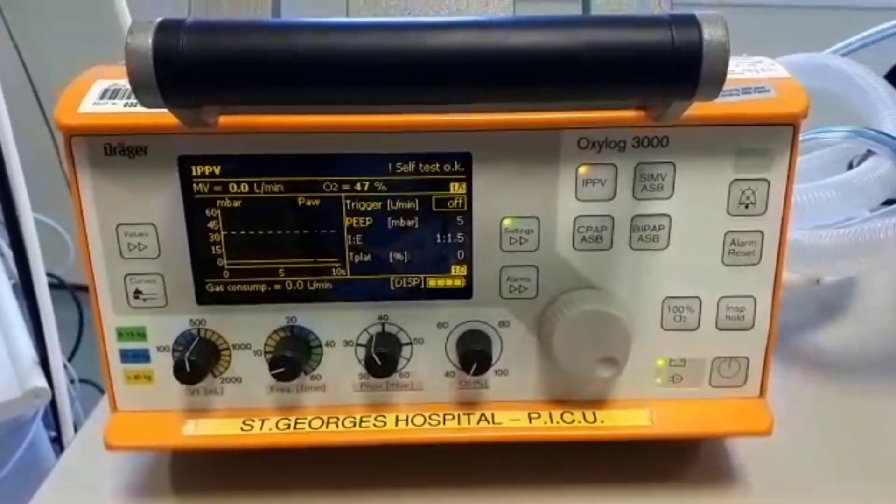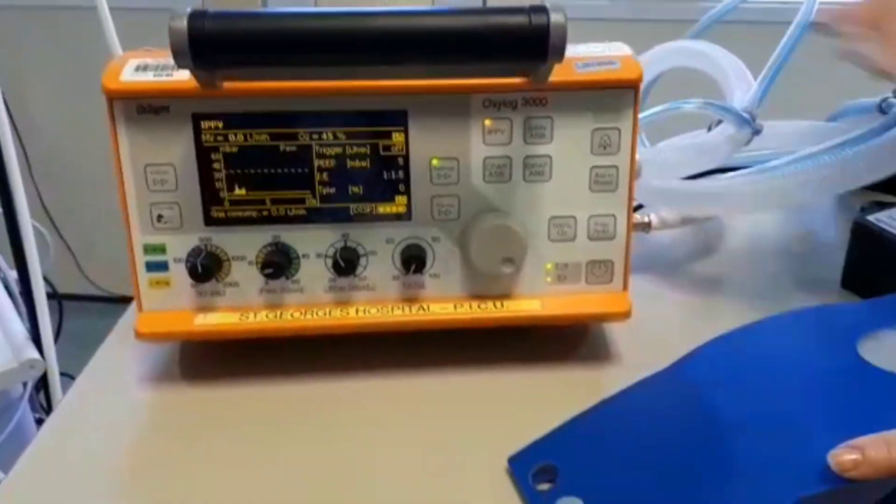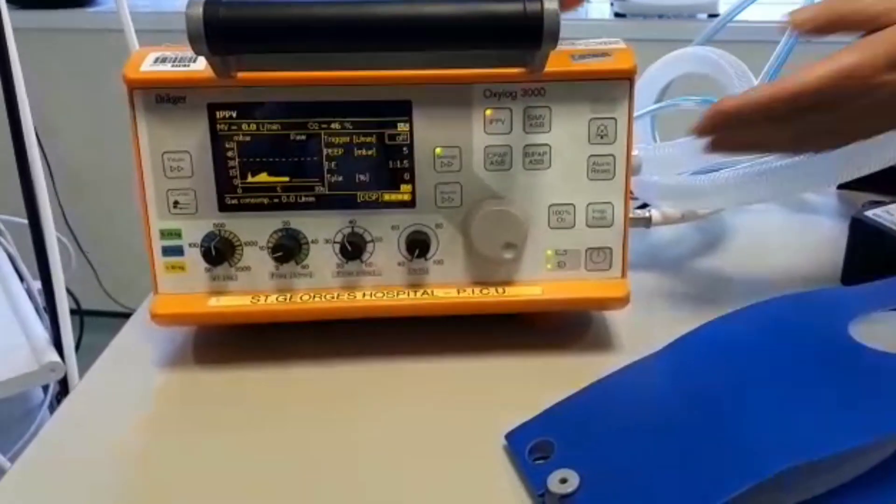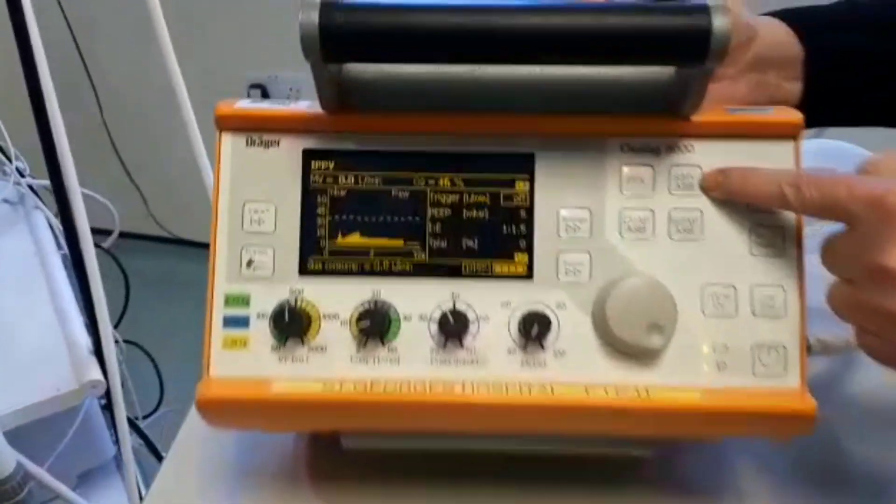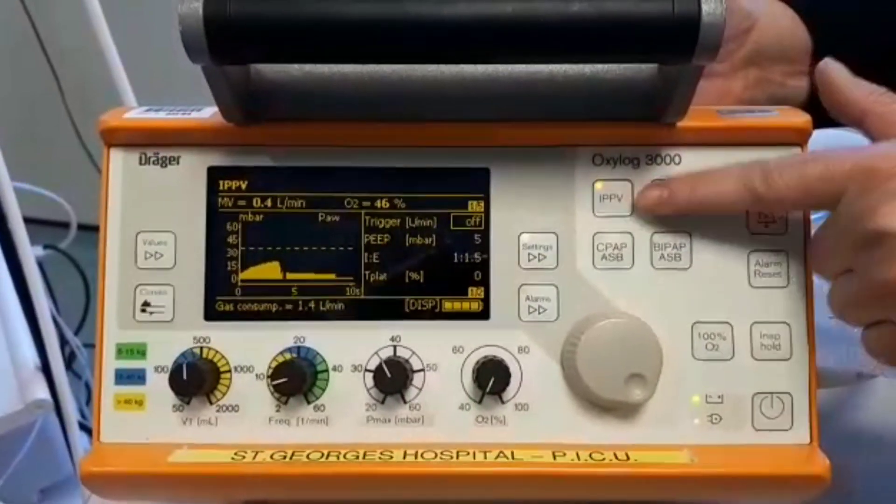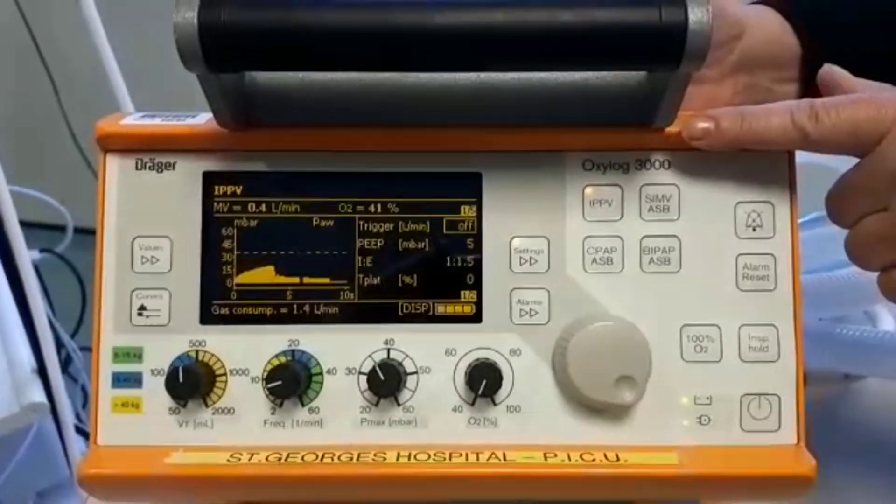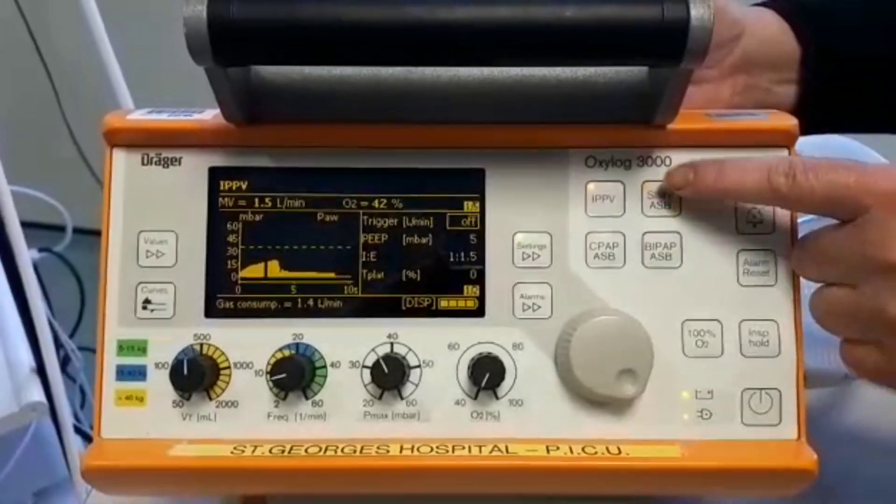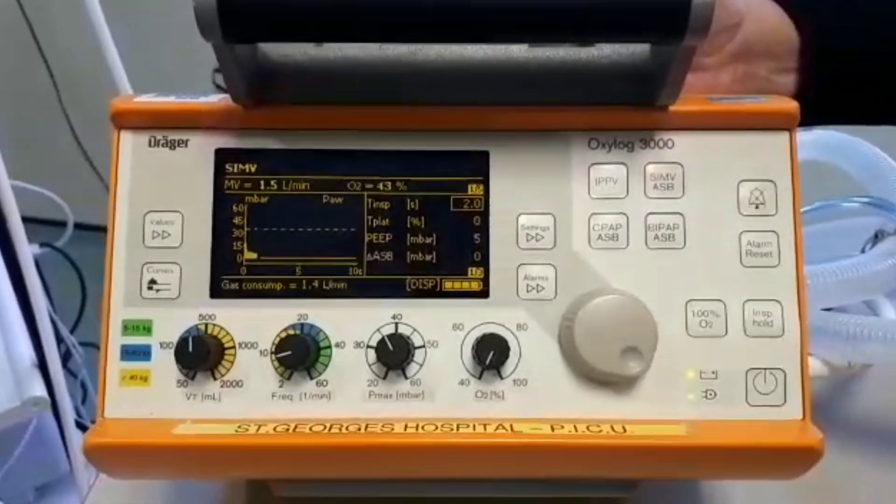I'm just going to connect to a test lung. This ventilator does not go into standby, immediately goes into ventilation. We have the choice of four modes here. And as I said, this is IPPV on this one, but on the 3000 Plus it's CMV. To change mode, you press until the amber light is flashing and press the control knob to confirm.